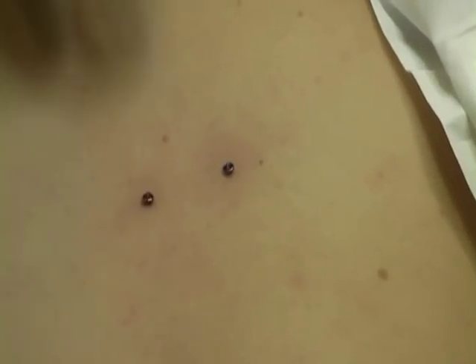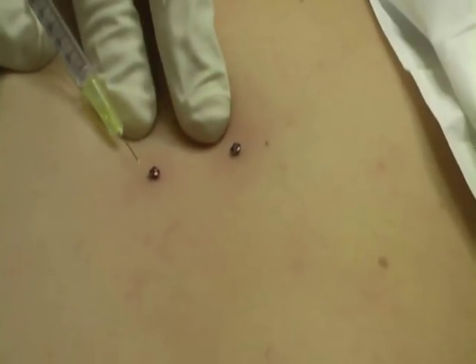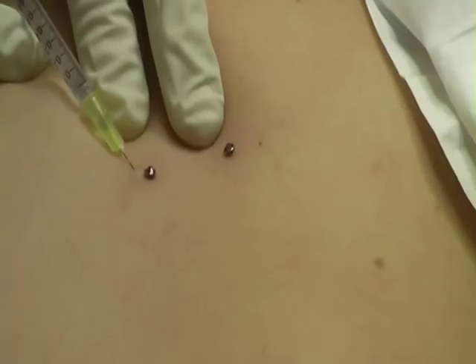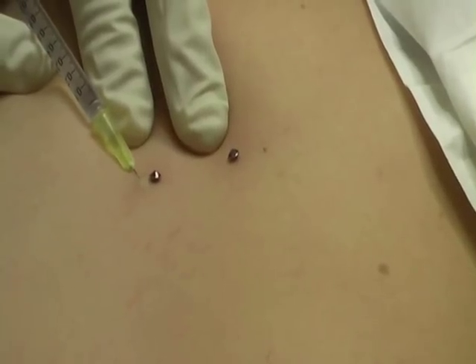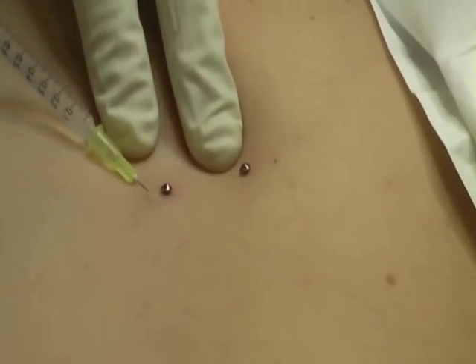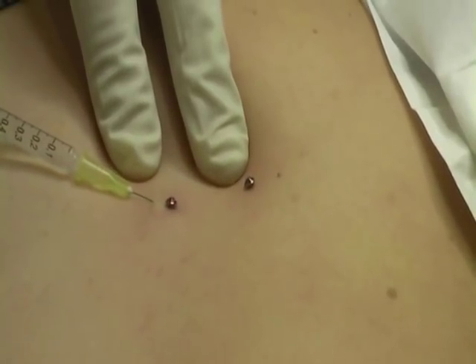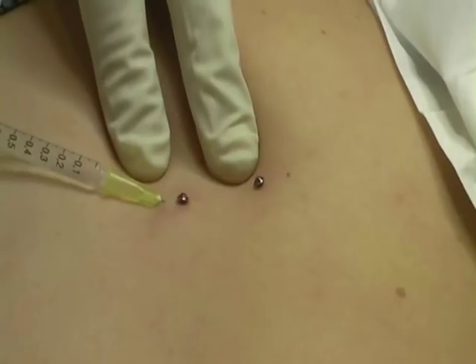So the first thing we're going to do is numb the skin. You're going to feel a little bit of a scratch as this goes under your skin, Zoe. Here we go — a little scratch coming up now. Well done. You'll probably feel a little bit of a stingy feeling. I'm just infiltrating the area underneath the skin just to try and make this as numb as possible.